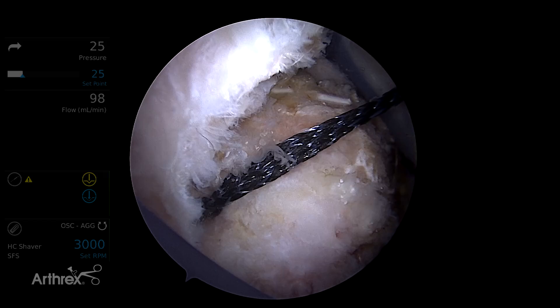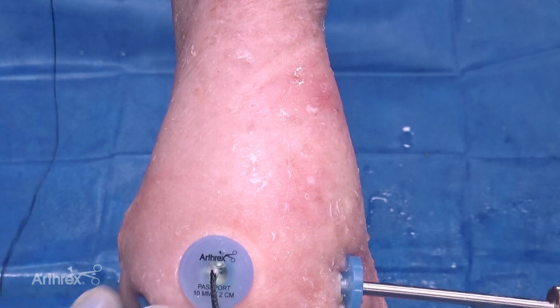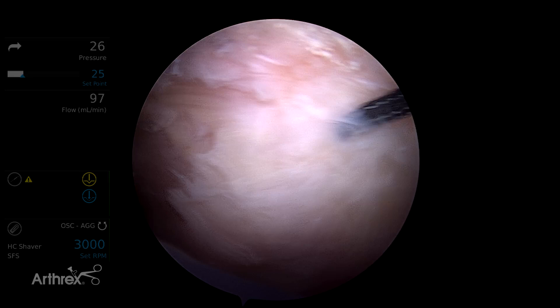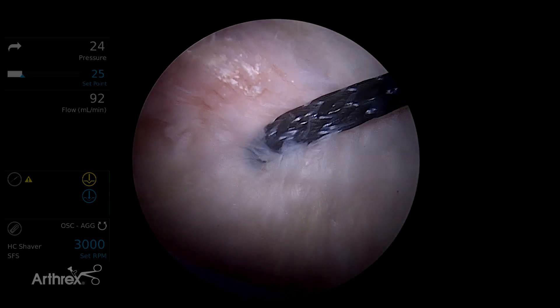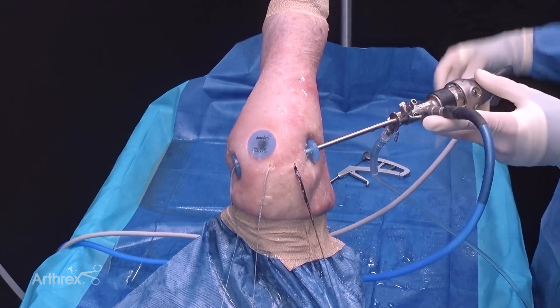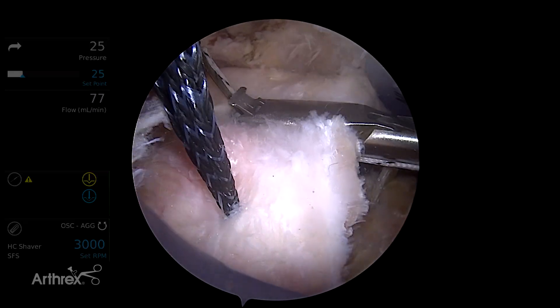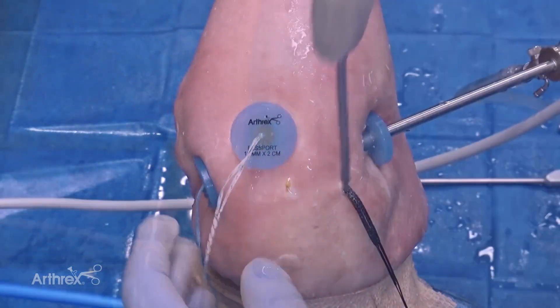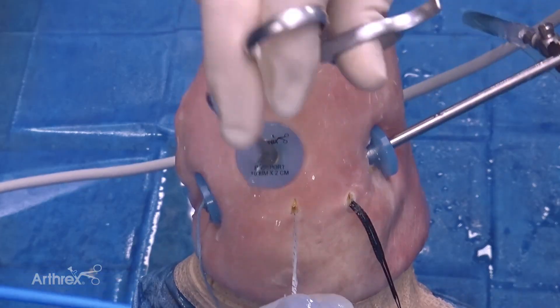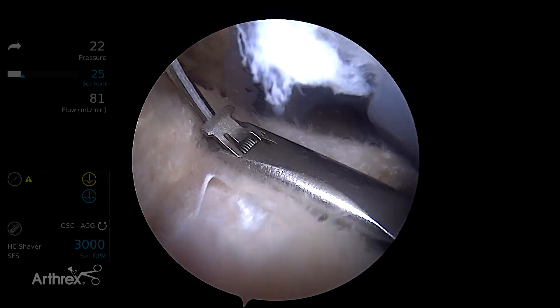Next we're going to pass these sutures through the rotator cuff. We retrieve a fiber tape out the lateral cannula. This fiber tape has joined tails so that it can be loaded onto the scorpion and allow a single pass of both limbs simultaneously through the rotator cuff tissue. I like to pass from posterior to anterior. Once the suture is passed we want to retrieve it out the same portal used for anchor placement. We'll then move to the middle anchor and pass the sutures in the same manner. Finally we retrieve the fiber tapes from the anterior anchor and pass those through the anterior aspect of the supraspinatus tendon.